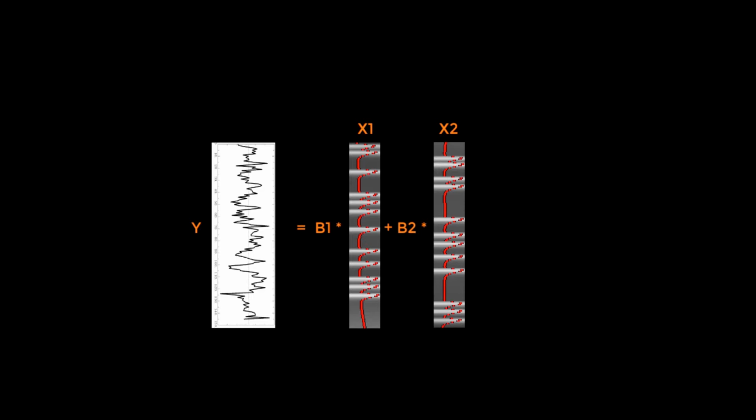So these also have numbers associated with them, but they're also continuous. They're being scaled by a certain amount, and we're adding them together at some point. So at each time point, we do have a single number that represents the sum of these two things, but we also have information about what we need to scale them by to get that sum.